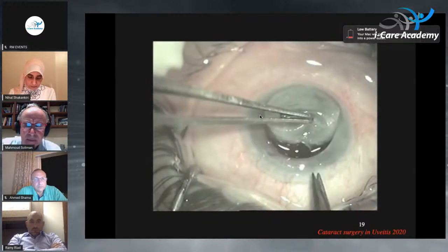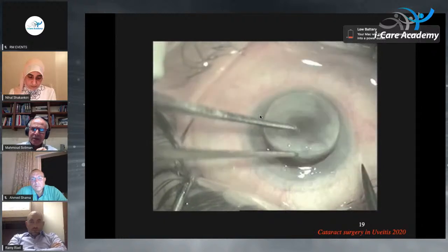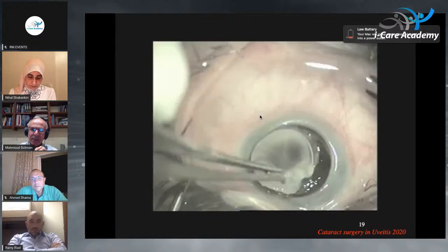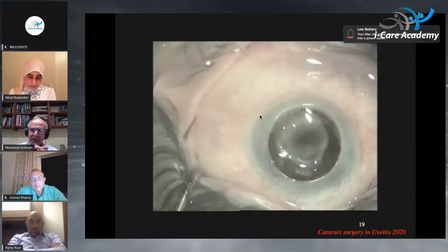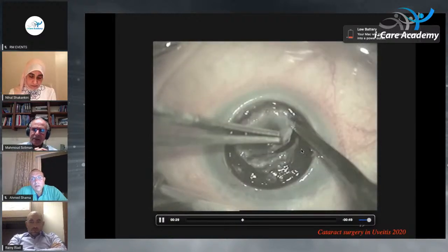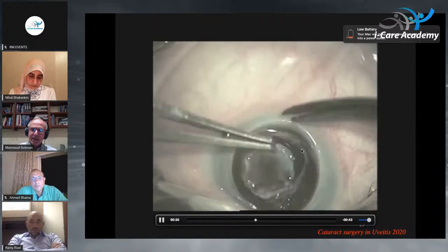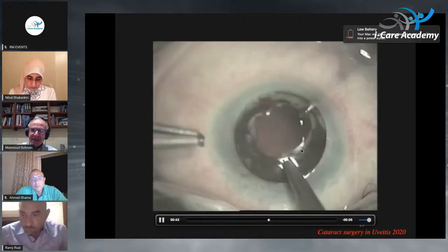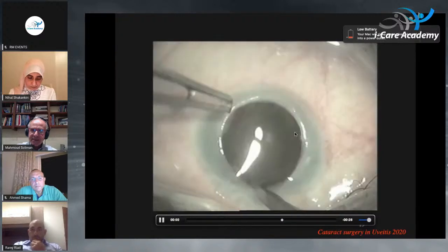This is what you mean, Dr. Ahmed. This is what ends up when a patient gets not a proper surgery. This is a JIA patient who had a lens implanted without vitrectomy, I believe, and she came to me like that. Both eyes had the same picture, and a total corneal opacity, a retrocorneal membrane, and you can see this cocoon. The lens is engulfed in an amalgam of fibrous tissue and encroaching on the iris, a very complex cocktail of tissue, which is really very weird.